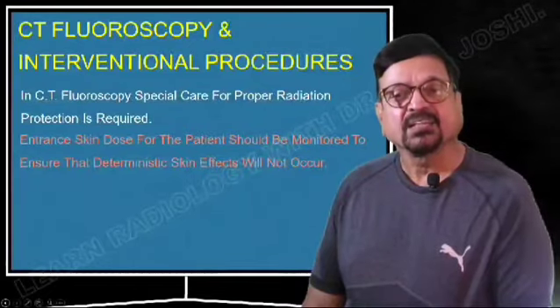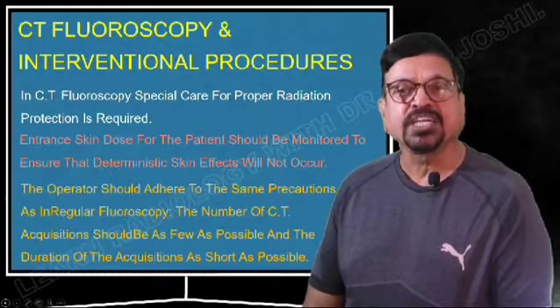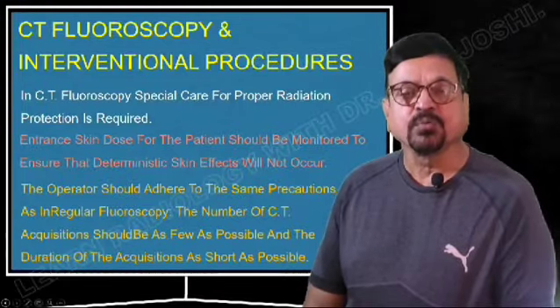minimum possible risk towards it. Now, the operator should adhere to the same precaution as in regular fluoroscopy.